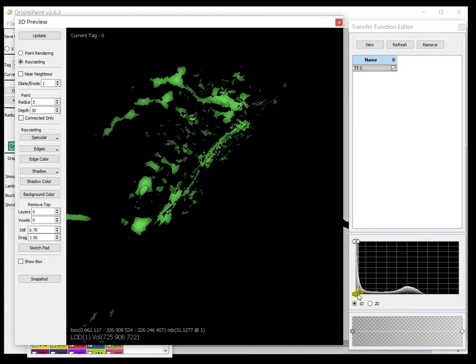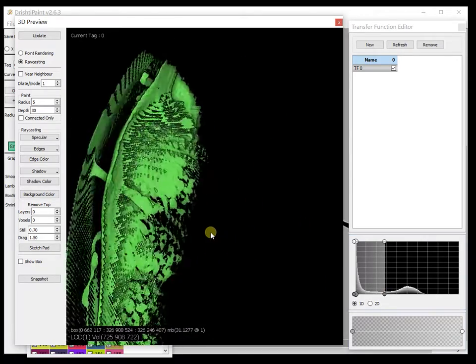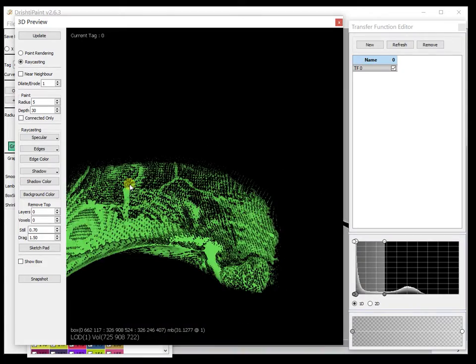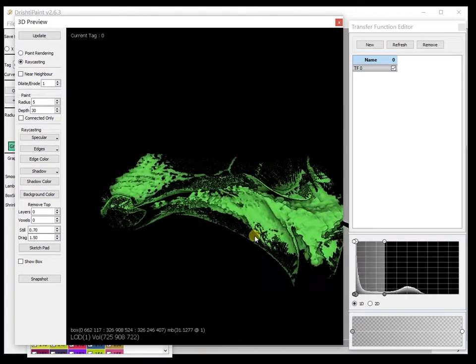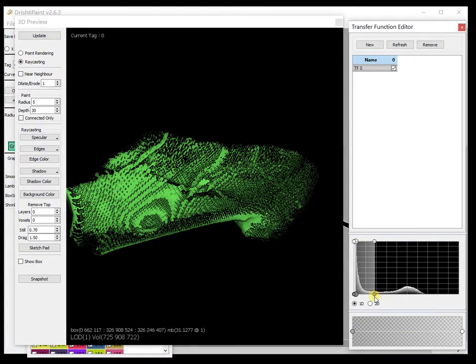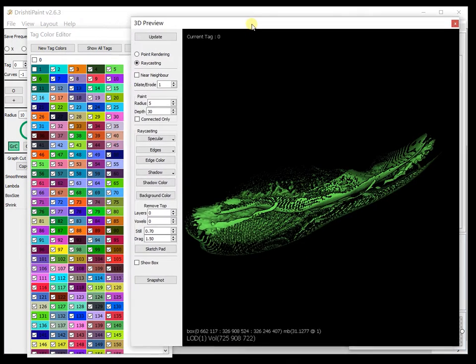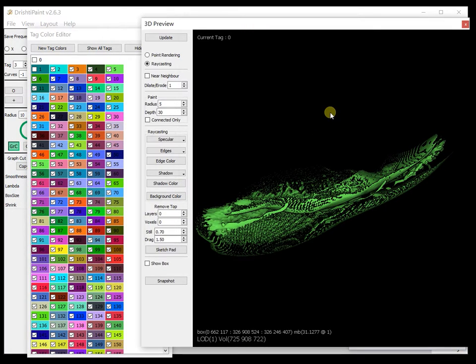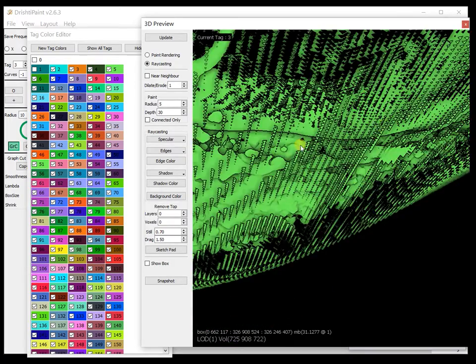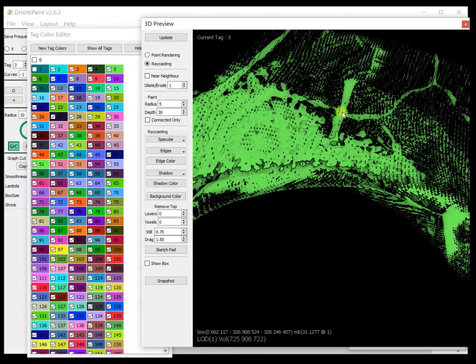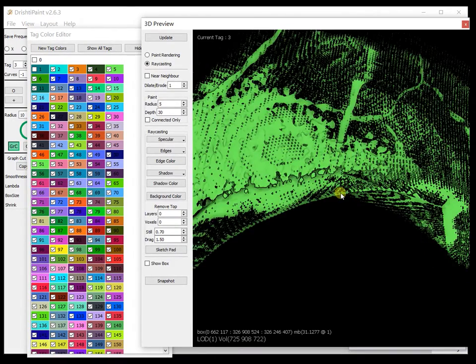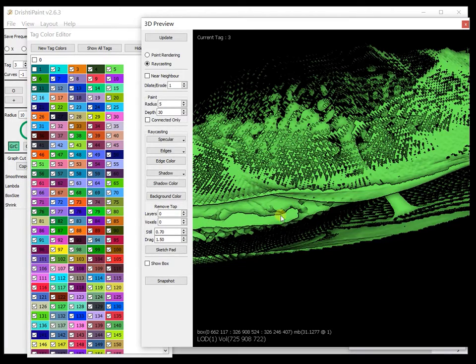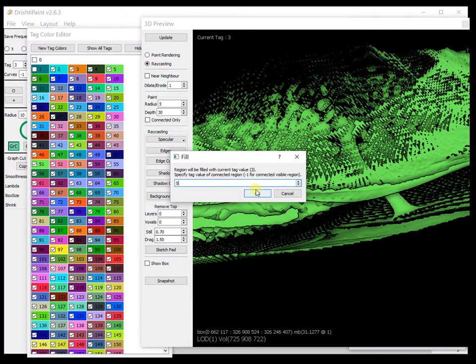Okay, now let us increase the transfer function and let us now tag this region here with a different tag value. Let's call it three. So this region here and this one here, hover over this and then press F. We want only tag number five to be filled with tag number three and that's only the connected voxels to this region here.